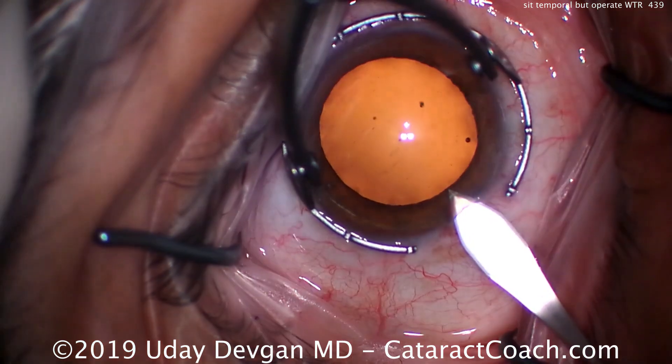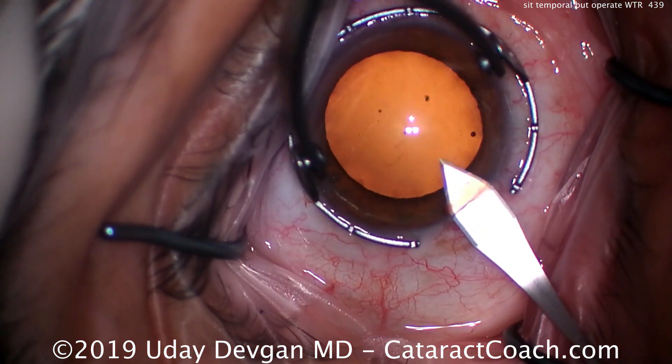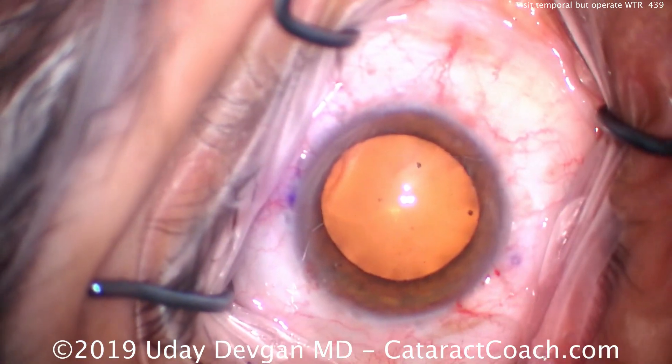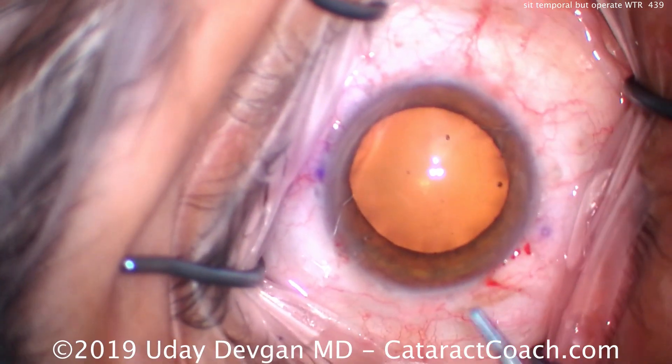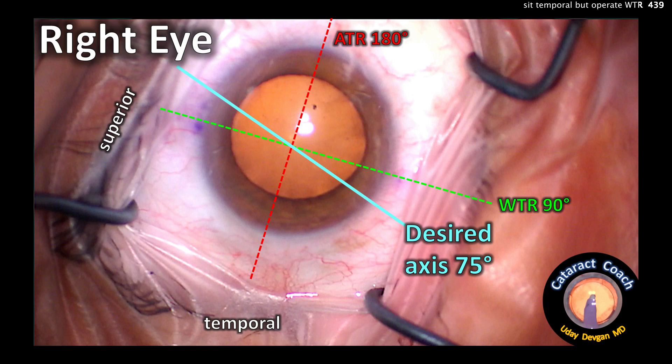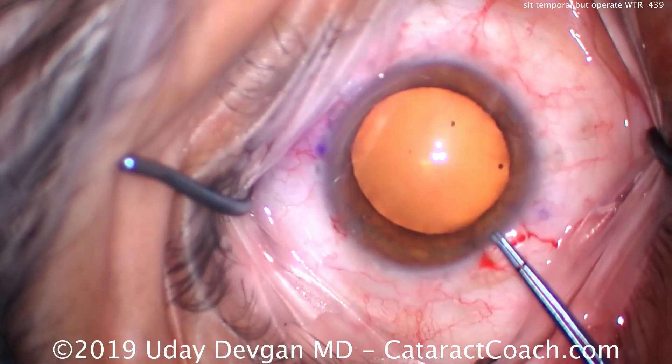We'll make our incision there. Look carefully — we've tilted and adjusted our microscope so that we can scoot over and sit a little bit closer to that 75 degree axis. We've moved the microscope and adjusted the patient's head position in order to make our incision on that steep axis at 75 degrees inferiorly.